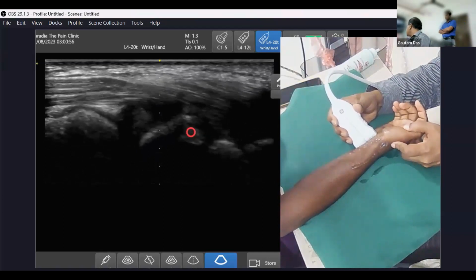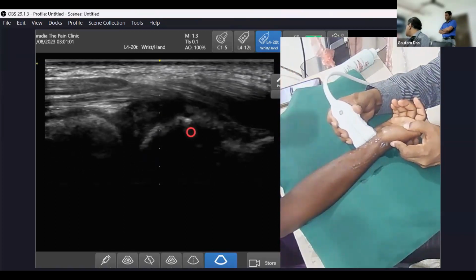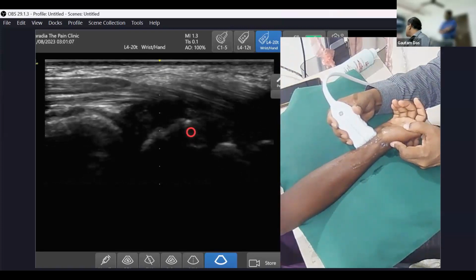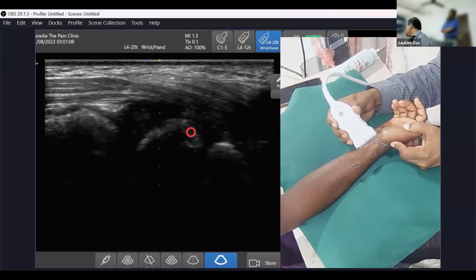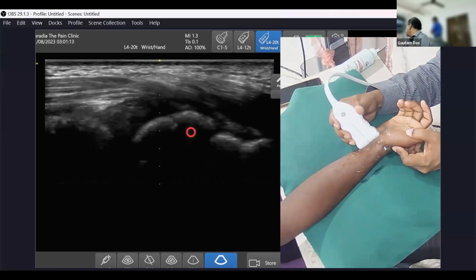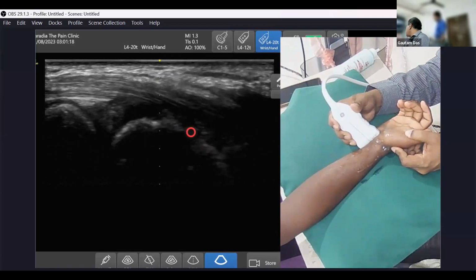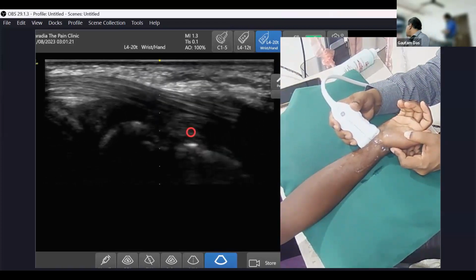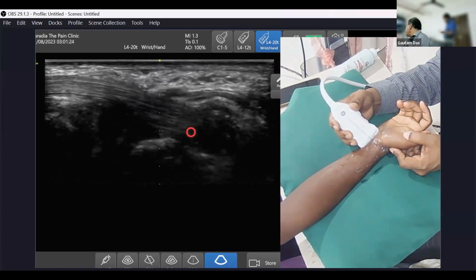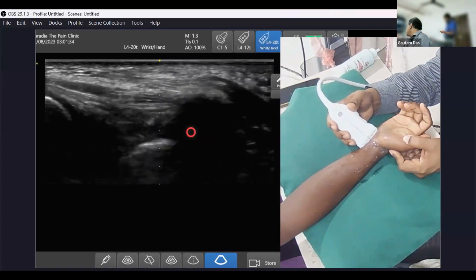One part of the bone is your ulna; the whole ligament is not seen. A little bit of area is hypoechoic. As I told you, the ligaments are basically sagging down, so the whole part might not be seen. Now at this position I'm fixing the ulnar side and rotating the distal part over the capitate. So now this ligament is your ulnocapitate. One side is your ulna, another side is capitate. If I rotate the probe further, this is the ulnotriquetral. The deeper one is the triangular.